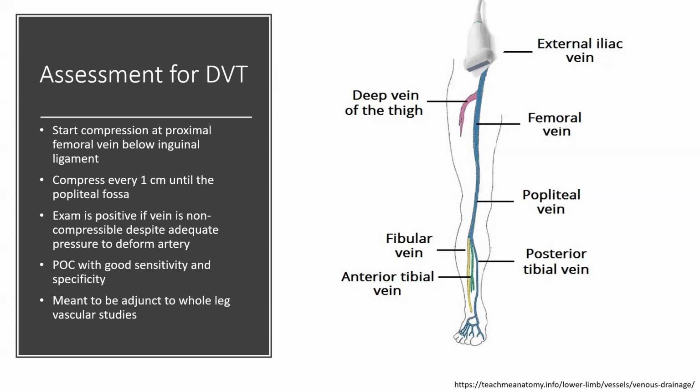thromboembolic phenomenon. Now, the absence of a DVT doesn't change the other findings or even change your pretest probability, but it could be a little bit of a slam dunk if you find more of that. There is some evidence that point of care studies have good sensitivity and specificity when compared to formal vascular studies, but these are not meant to replace those. So this is not a DVT talk this time, but just a quick idea of how to do it.